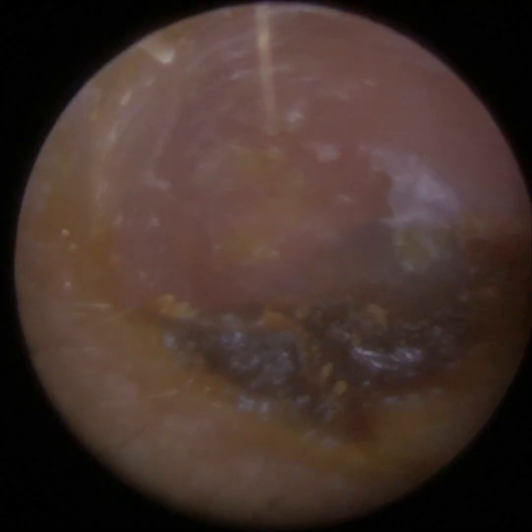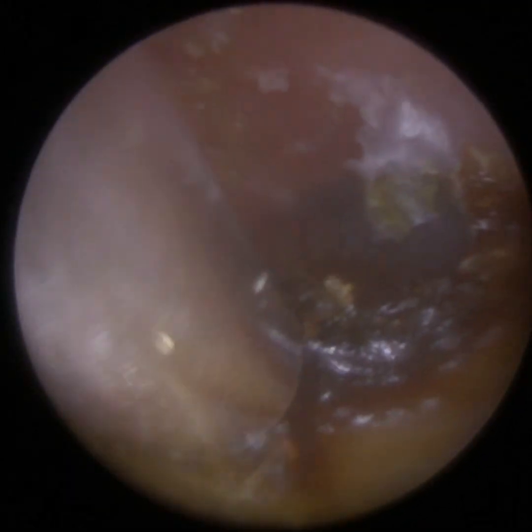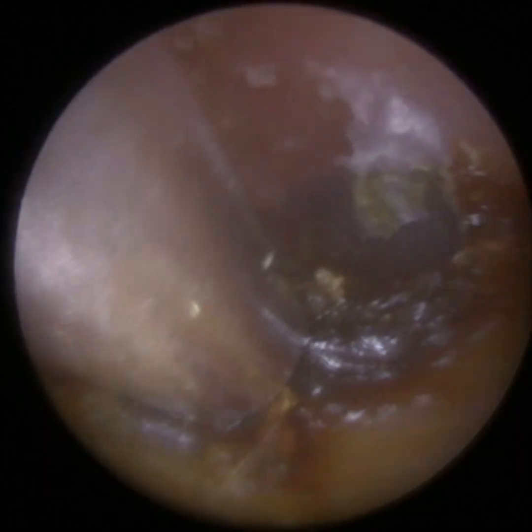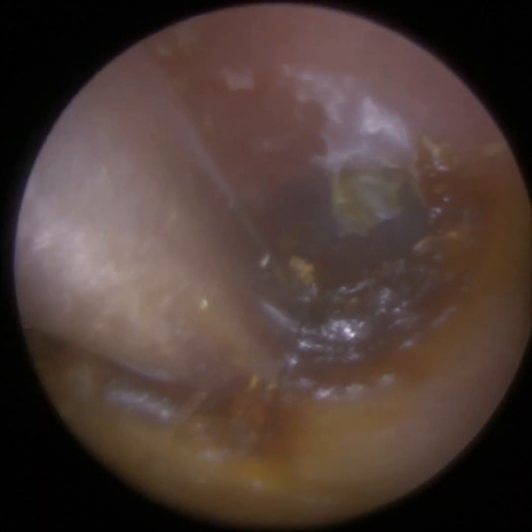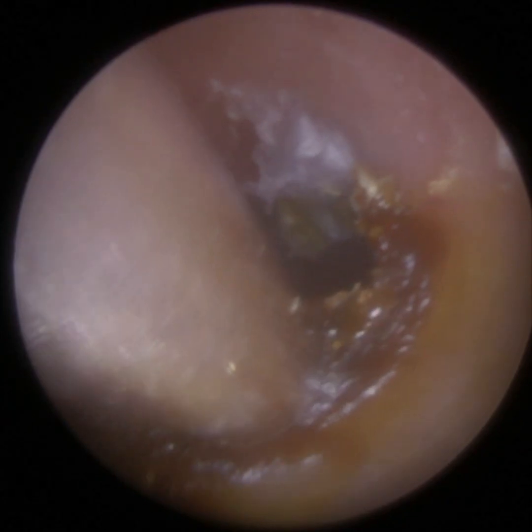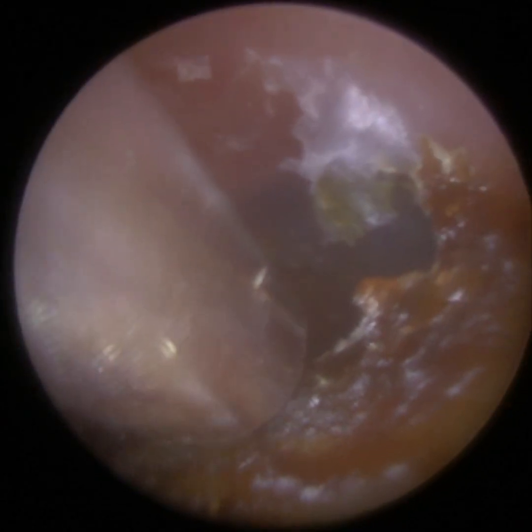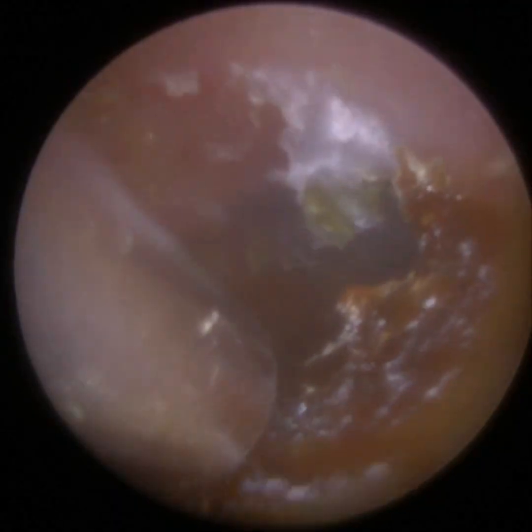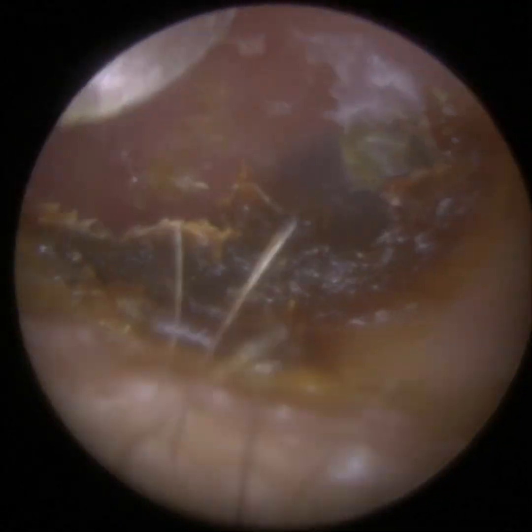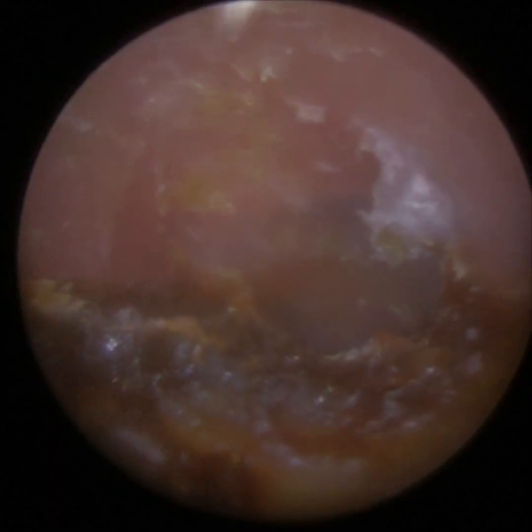So the eardrum is now more or less visible. However, once we remove this dead skin and wax off the mid-canal, we're going to go back in, and there are some hidden sheets and shards and slithers of really dead, hard keratin, almost sharp like a shard of glass, but it was hidden away in the patient's inferior recess, which is a little trench at the base of the eardrum.